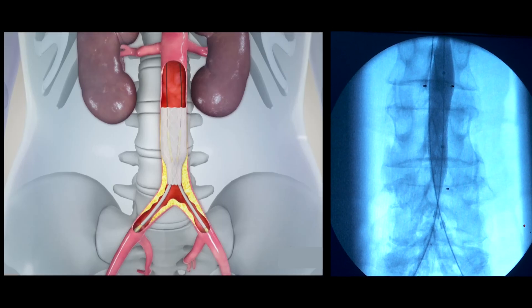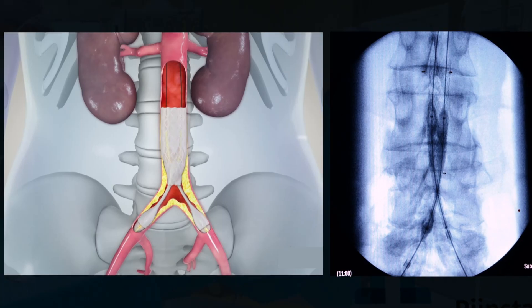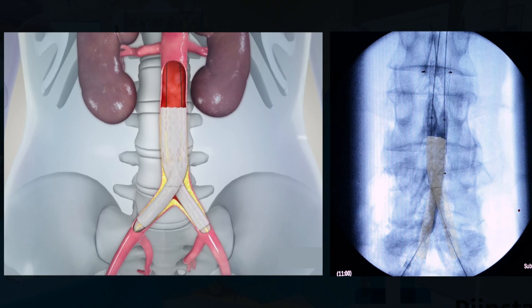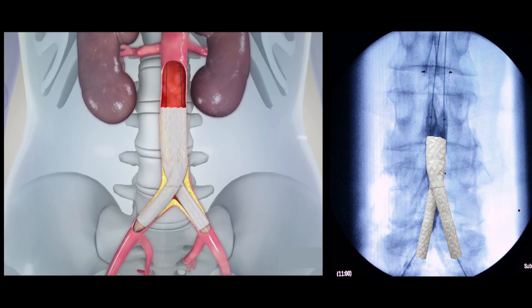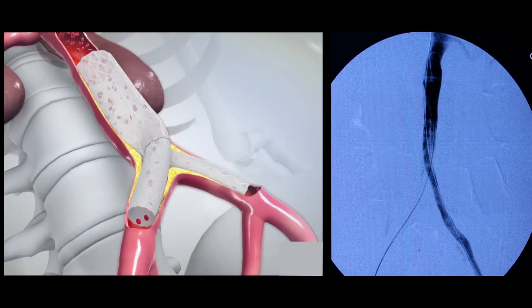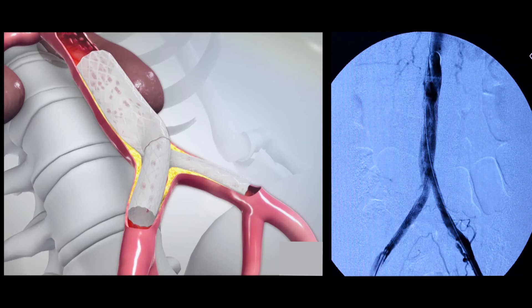When this stent is placed, two extra stents are being placed into the first stent on both iliac arteries to get the final result. On the final angiogram, you can see that the abdominal aorta and the iliac arteries have a normal patency.